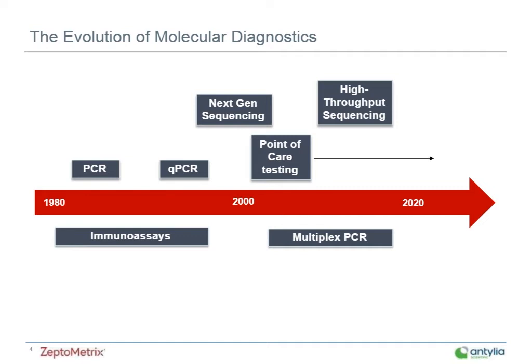So with the completion of the Human Genome Project in 2003 and technologies like next-gen sequencing, high-throughput sequencing, there was really an incredible amount of data and information being generated and gathered at this point in time. So this massive influx of information and the need for labs to quickly and accurately diagnose infectious diseases really spurred on the development of these point of care systems that we're familiar with today. And obviously that area continues to push forward with brand new innovations.